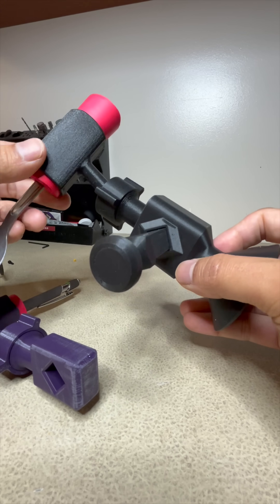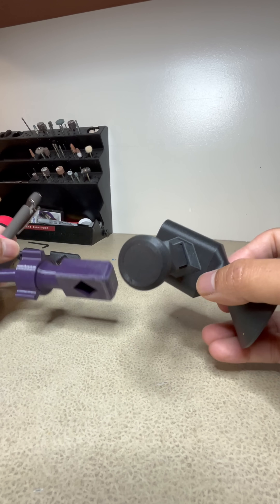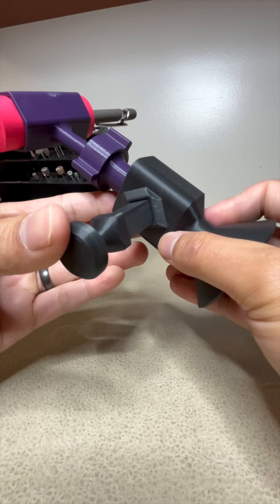You can switch the tool to something else like a stylus holder. We'll see how this works and make more tools down the road.